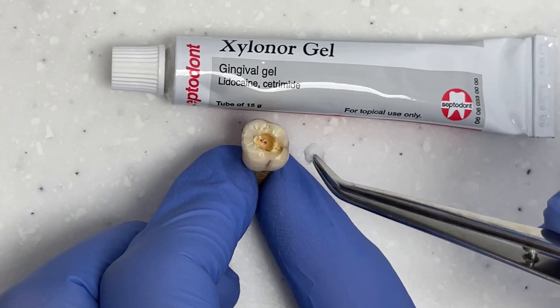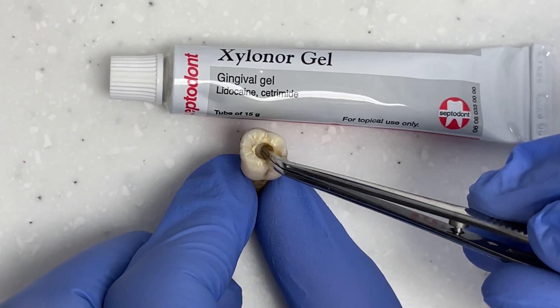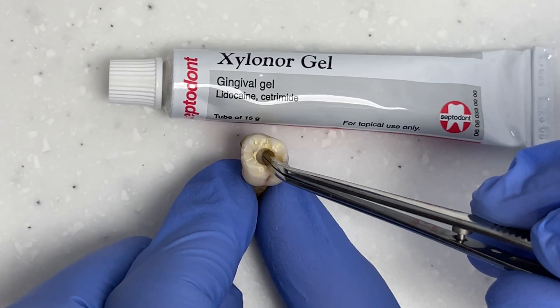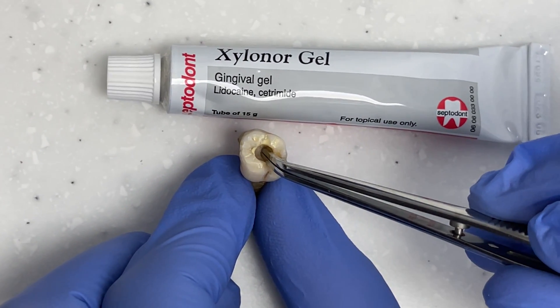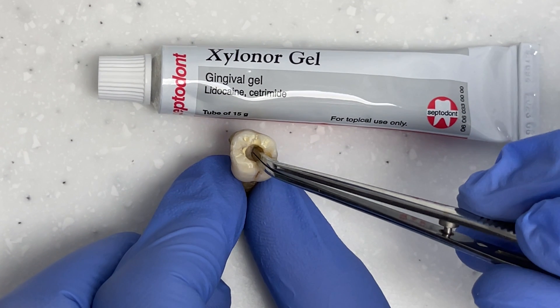The next tip is for those irreversibly inflamed pulps which just keep on bleeding and you can't control it. Once you've gotten access to the pulp and it starts bleeding, what you can do is place some topical gel on a little cotton pledget and put it into the pulp chamber and hold it for five minutes.